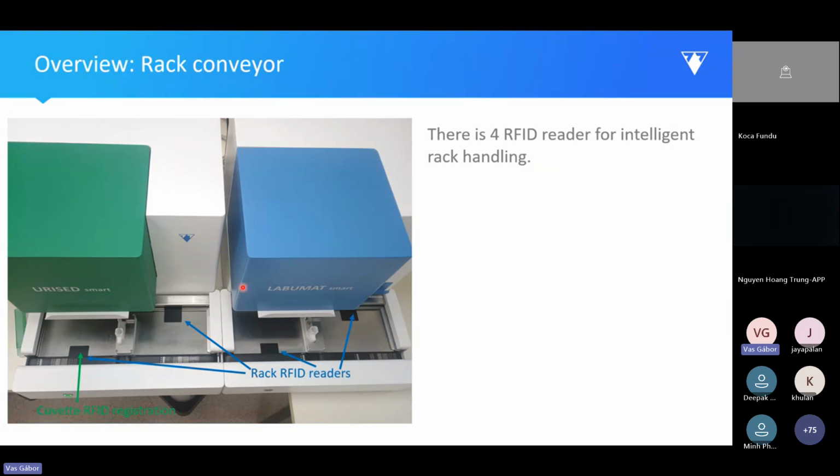Okay, so now this is an overview of the rack conveyor. The rack conveyor is very sensitive.